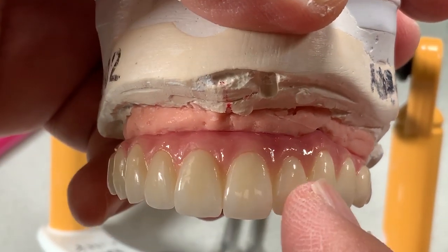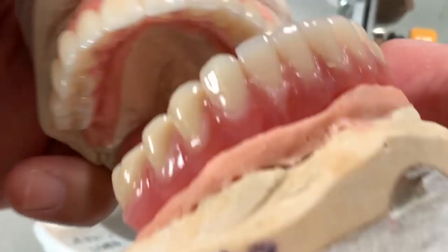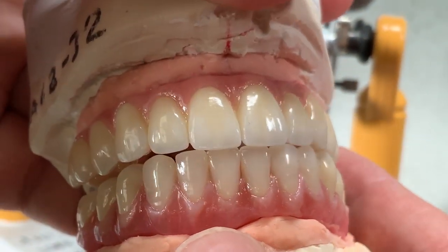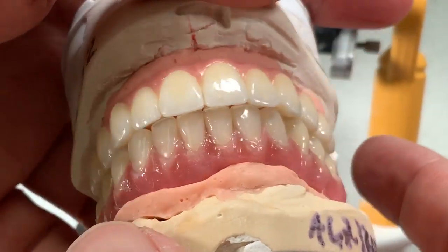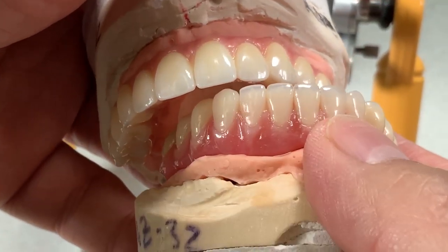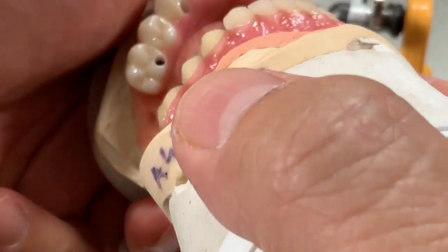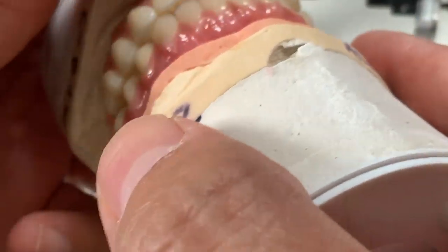Guys, I like the color, the shape and contours of the lowers, even though we have two different laboratory technicians, similar to the cases. The occlusion is good, the teeth are a composite setup. Okay. So this is the beauty, the art, finished up.